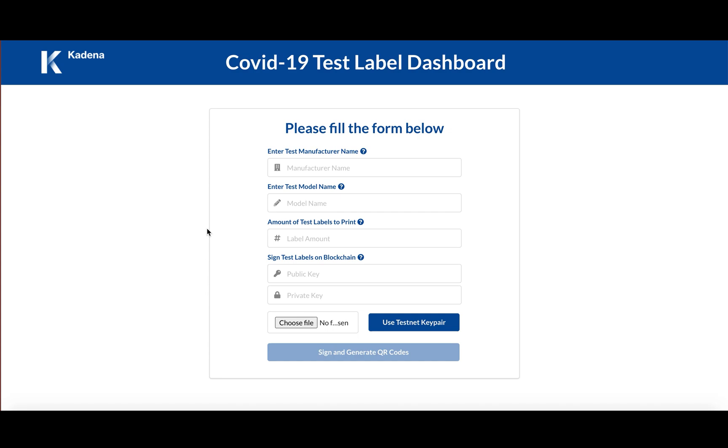The aim of the platform is to facilitate both test manufacturers and clinicians and any entities involved with COVID-19 test tracking to facilitate tracking the validity of a test.